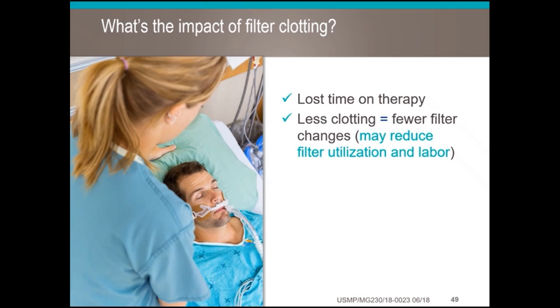So what's the impact of filter clotting if you have a filter that clots when your patient's on CRRT? Well, obviously, lost time on therapy is one, because when your filter clots, your patient's not getting any therapy, and you have the time for filter changes that's going to impact that. If you have less clotting, it means fewer filter changes, and this may in turn reduce how many filters you have to use and the labor intensity for the nurse. So those are some things that you can consider.